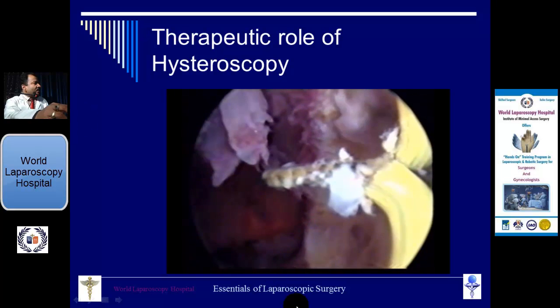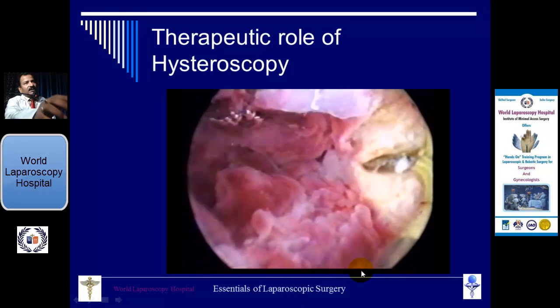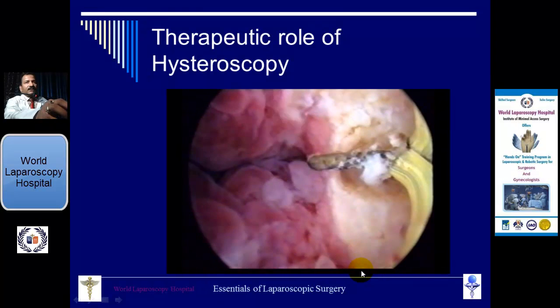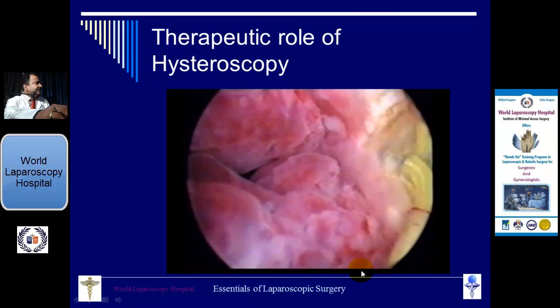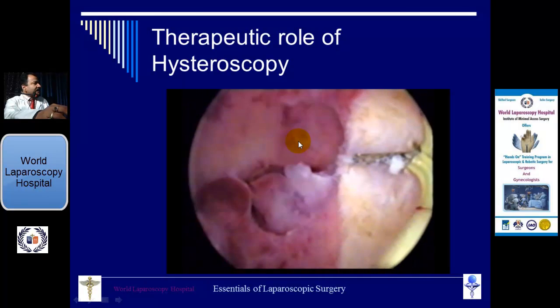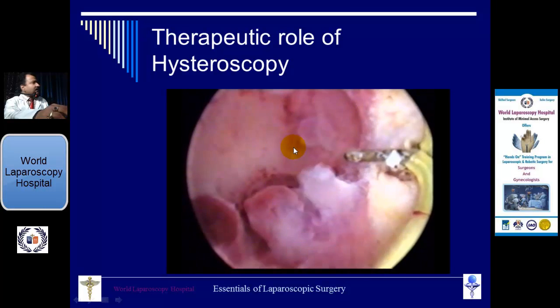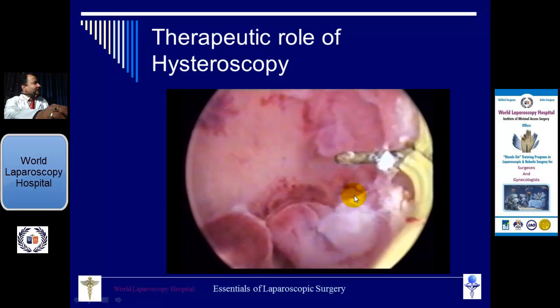Sometime again you can call for transillumination, and your assistant who is holding the telescope from above will bring the laparoscope almost touching the uterus. That way transillumination can give you the idea whether it is finished or not. This way it can be performed with the metroplasty. And sometime if you are going to check the tube for patency, that also you can do together.